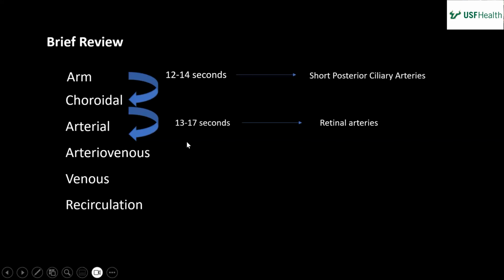You can't rely on the counter on the cameras because you don't know when they start. That's why I showed this case to my partners, and most of my partners would not have gotten a carotid study, because a lot of people don't trust the timer. I trust the timer, plus I do a lot of my own pushes, so I know it's right when I hit the timer. The other thing is, to have a delay on the timer means they hit the timer before you even checked it, which would be weird.